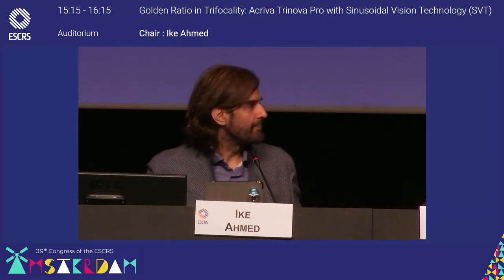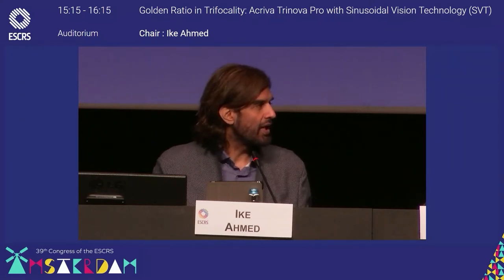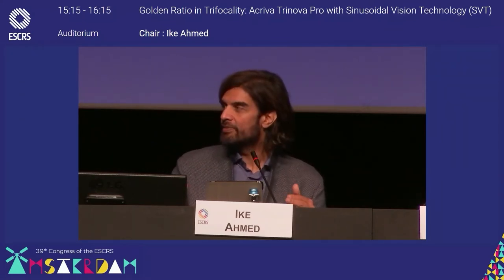I think that's kind of been our go-to for now. I think the Kane has some promise as well. But I've been using Barrett for the most part. Okay, second question: what do you aim? I know many people with monofocals will typically aim a bit myopic. What is your preference for how you target this lens?